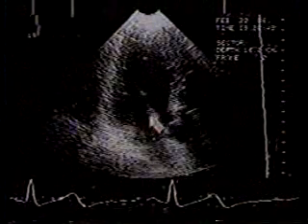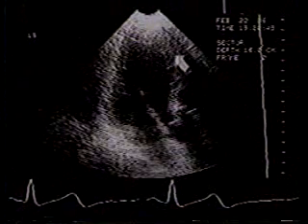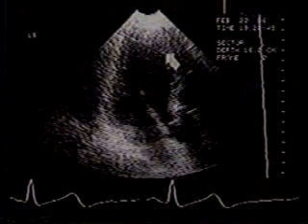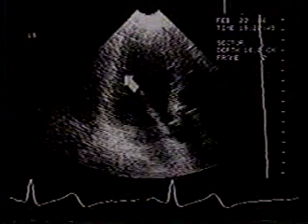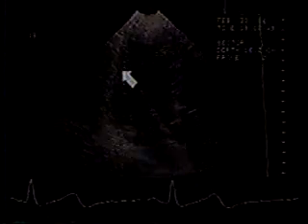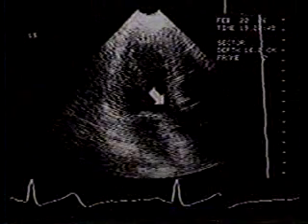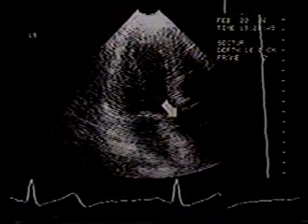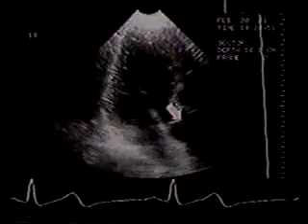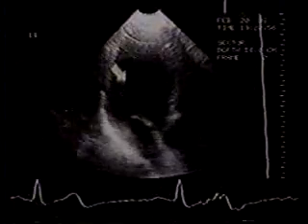In the long axis orientation, we can inspect the anterior portion of the ventricular septum, supplied by septal perforators from the left anterior descending coronary artery. This is the inferolateral wall, which may be in either circumflex or right coronary artery territory. In this systolic frame, the left ventricular outflow tract can be identified, leading to the opened aortic valve. In real time, note the motions of the aortic and mitral valves and the uniform contractility of the left ventricle.